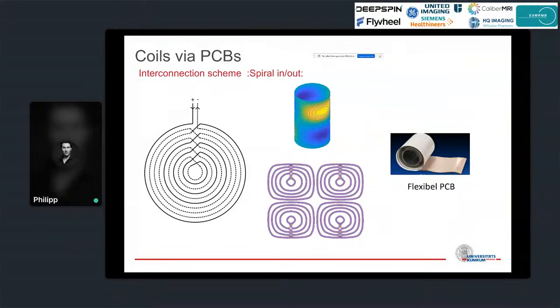It has 2 layers, a spiral in, spiral out approach, which helps you reduce the number of feeding wire paths. For each contour, you get a spiral in group and a spiral out group, and then you get 2 layers which you need to print via PCB.